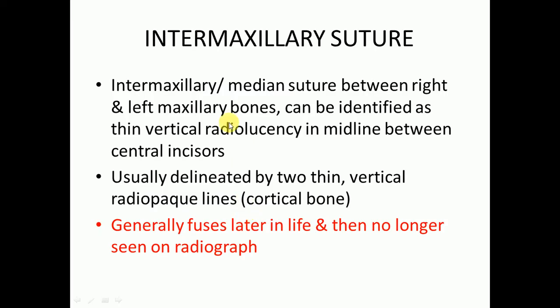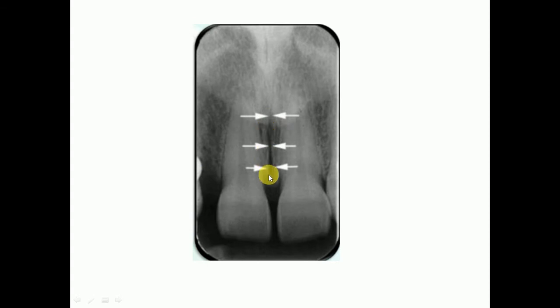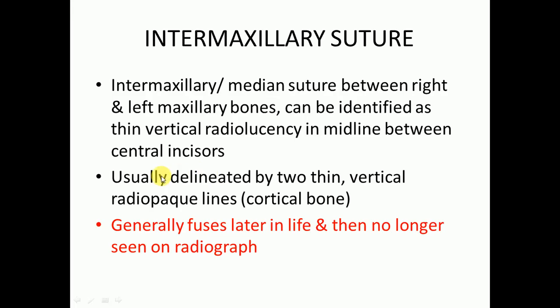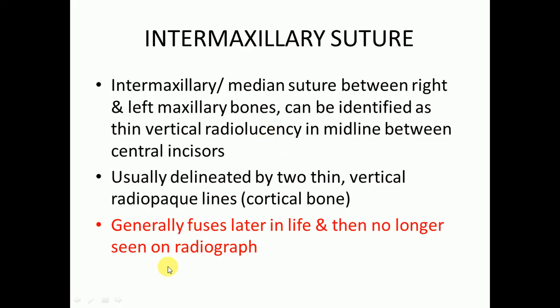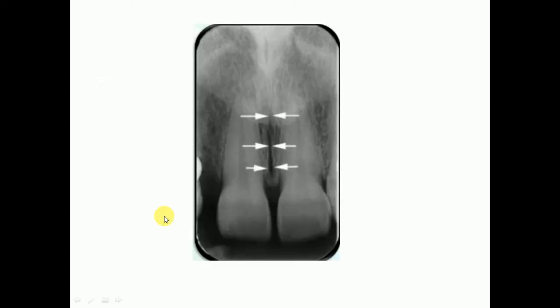Then we have the intermaxillary suture. The intermaxillary or median suture between the right and left maxillary bones can be identified as a thin vertical radiolucency in the midline between the central incisors, usually delineated by vertical radiopaque lines of cortical bone. It generally fuses later in life and is then no longer seen on radiographs.